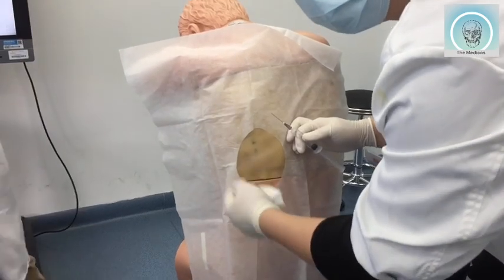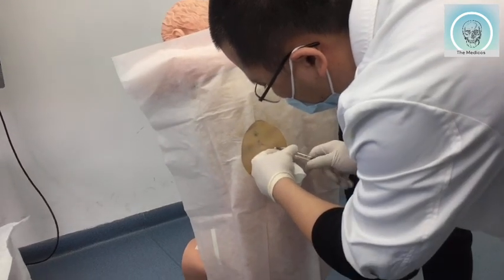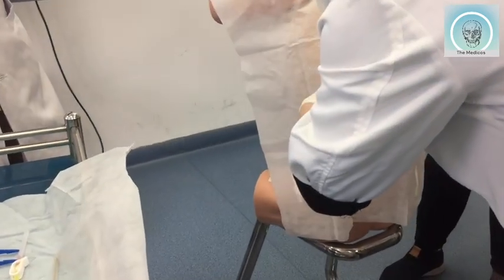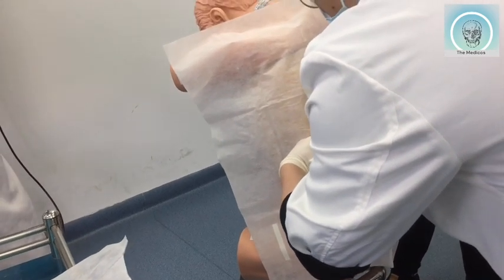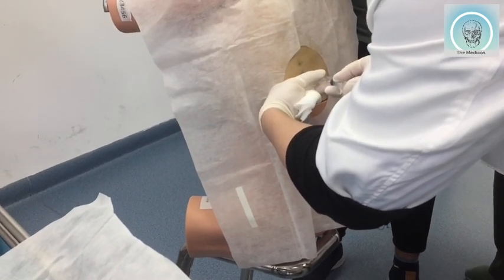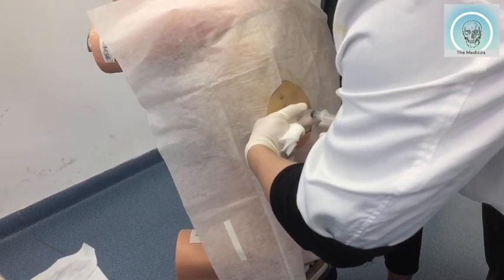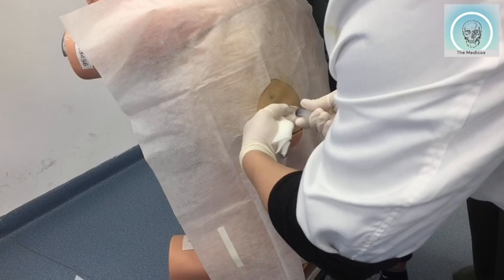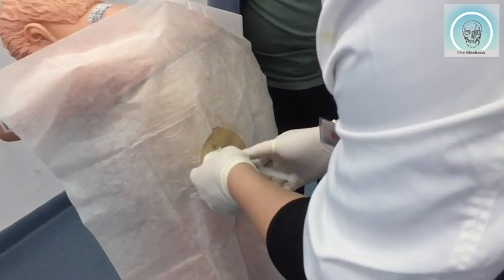Patient usually moves his body when I do the procedure. You should feel the other side of the rib, okay? The other side of the rib. Just like here and the right direction. Feeling that. So every time when you push the needle in, you should pull back a bit to make sure you didn't aspirate into the artery. Then if there's no blood, then you can push the anesthetic inside. Okay, so you see that you have stopped the injection.